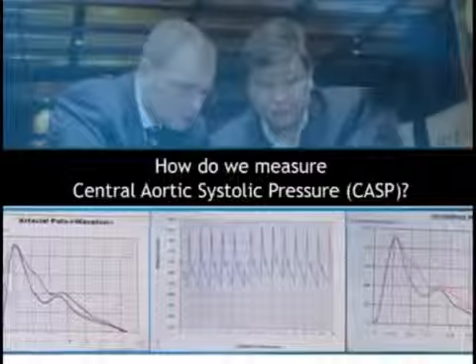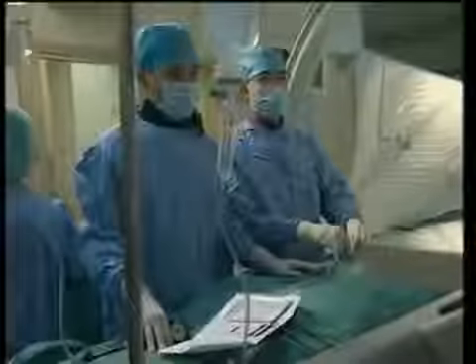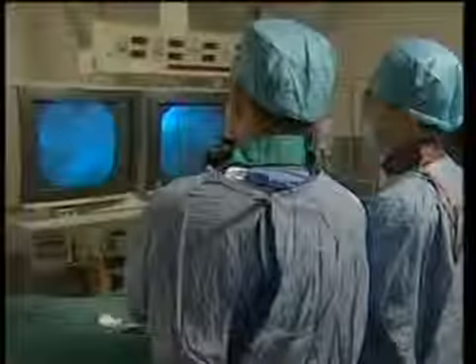So how does one measure the central pressure? If you want to be accurate, you have to go through a very invasive method which is completely impractical. You cannot be subjecting everybody to such an invasive method. Well, you have other methods that come from a fairly bulky machine that has a sensor that looks like a chopstick, and it takes a little while, more than half an hour, just to figure out. And it is not only bulky but very expensive.